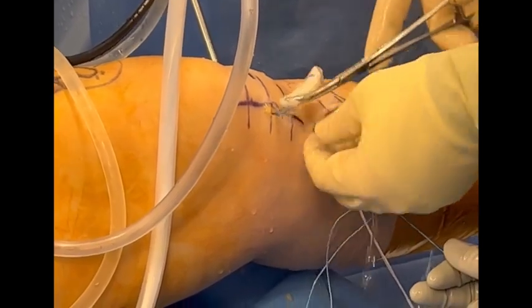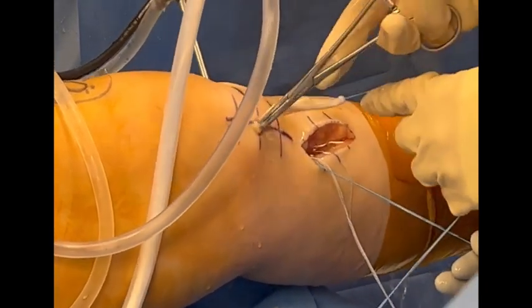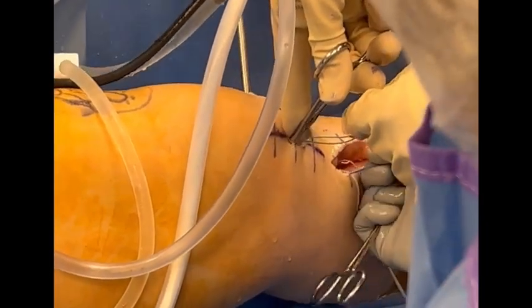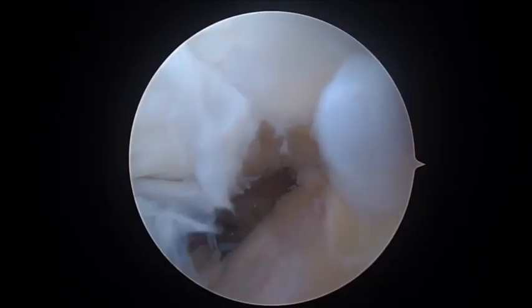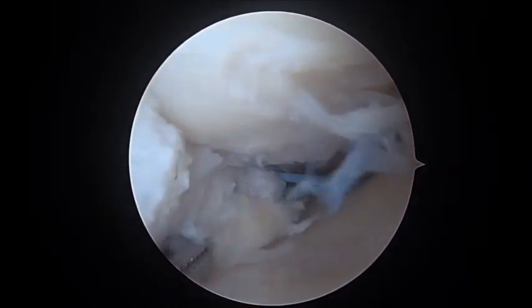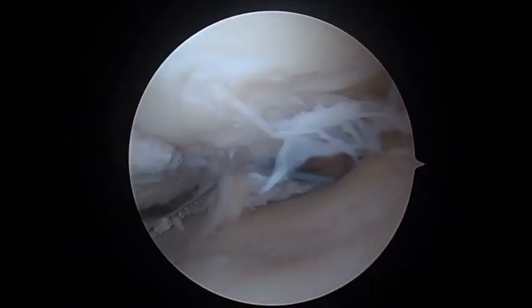The graft is then inserted through the dilated anteromedial portal and positioned posteriorly. Of note, an arthroscopic probe can be used to help position the allograft in the correct position posteriorly while pulling tension on the sutures that were previously passed through the posterior root tunnel, as shown here.